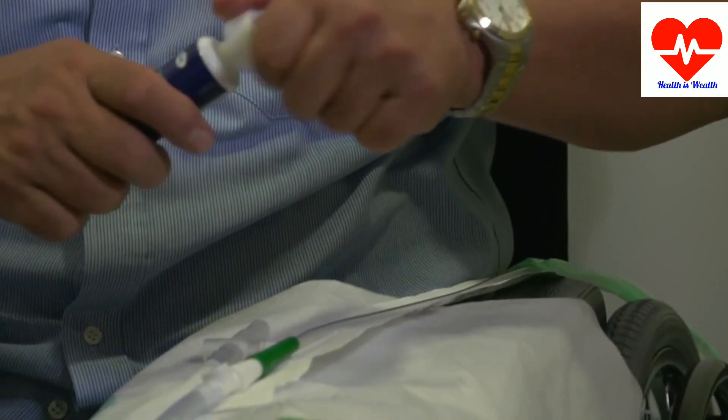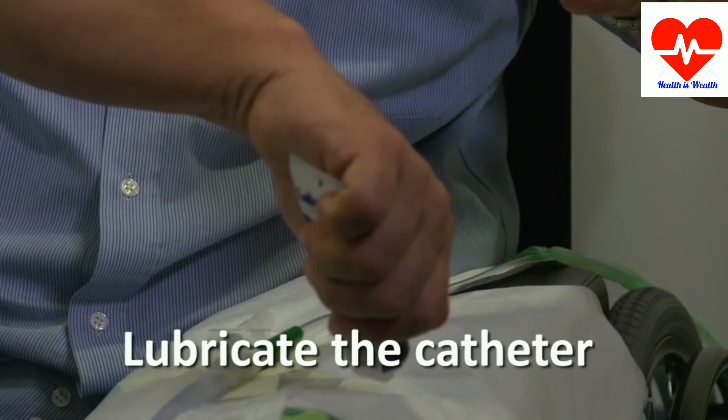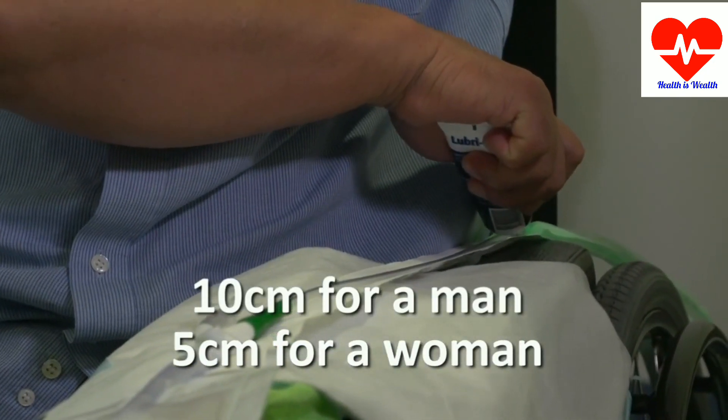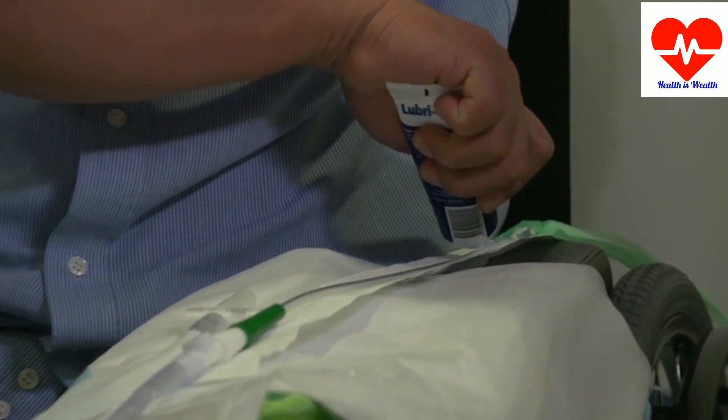Now cover the start of the catheter with lubricant. If you're a guy you'll need about 10 centimeters of lubricant. If you're a woman, about 5 centimeters.